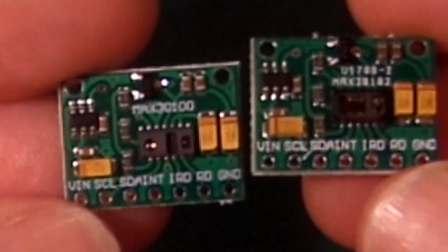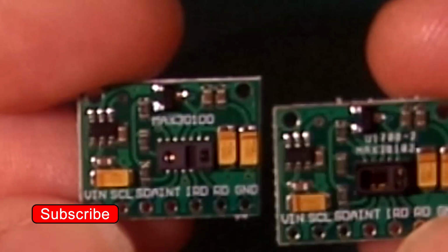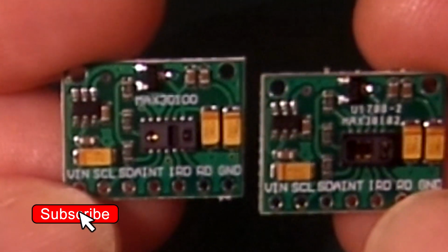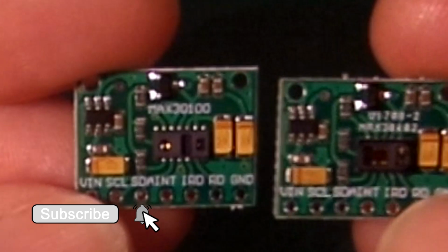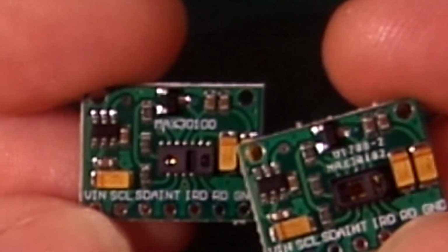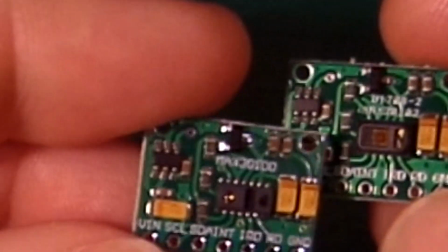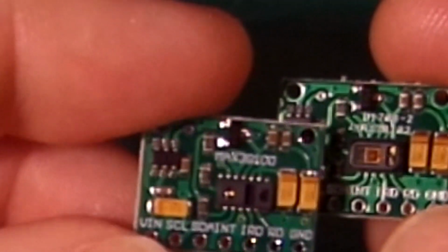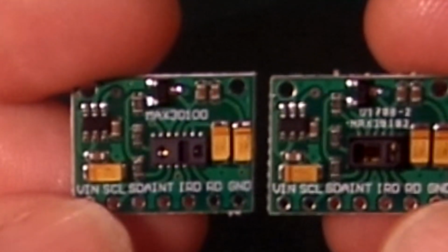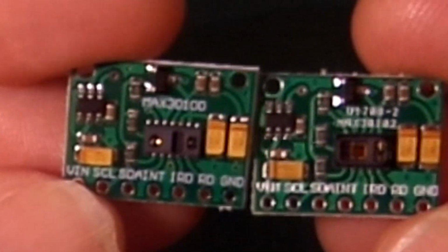These are I2C devices. There's quite a lot of connections on, you can see. These came with the pin headers for you to solder on as well. But they are I2C, and the way you use them, you've got to read from an internal buffer. On the 30100 version, it's got a 16-byte buffer. And on the 30102 version, it's got a 32-byte buffer. In everyday use, from what I can think we'd be using them for, I don't think that'll make an awful lot of difference. Now, there is a problem with these.